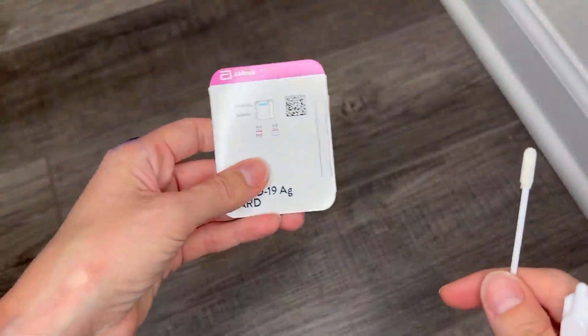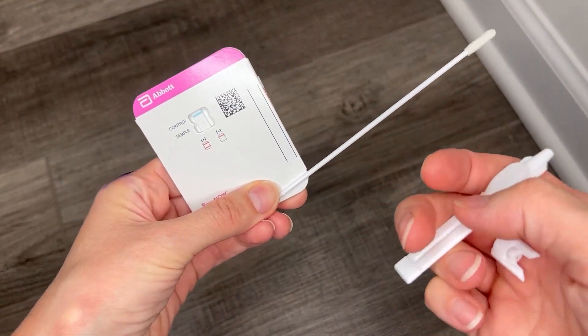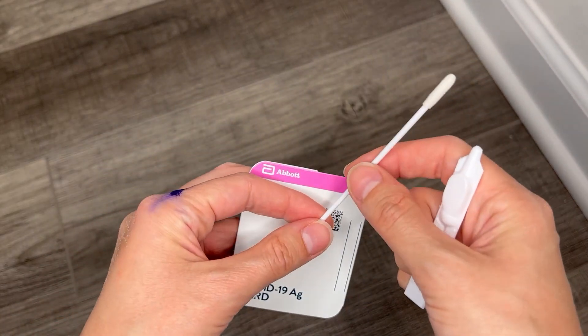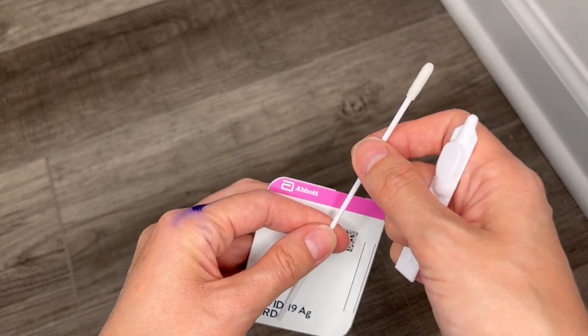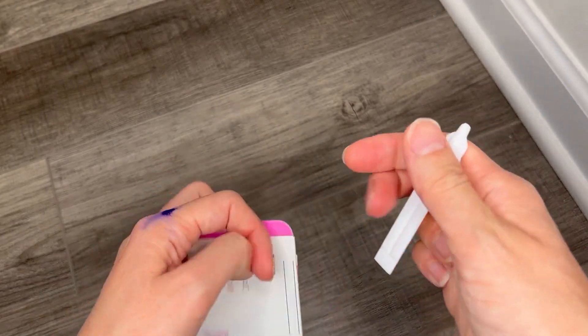So basically it comes with a test card, a nasal swab, and a dropper bottle. I already opened the nasal swab. Everything comes pre-packaged, protected. So we're just going to put this to the side because I'm not going to use it, I just want to show you.